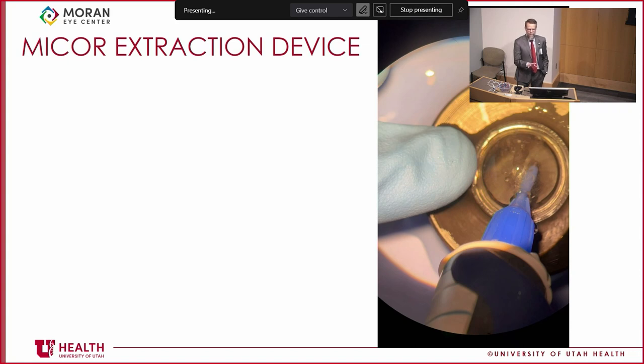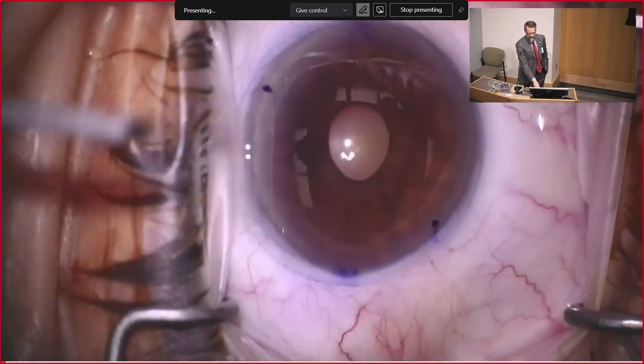So the sound is noticeable. You walk by the room, you're in the room, you're hearing the sound. And I actually had a patient, just anecdotally, last week. Once that sound started, she actually asked for more sedation. It was a little bit unsettling to her, which was an interesting phenomenon. So you've got that clicking happening.